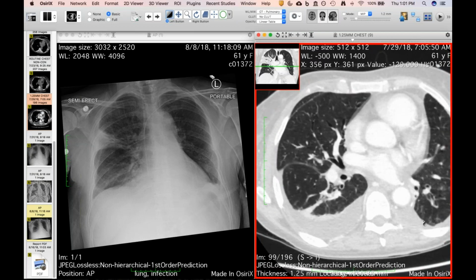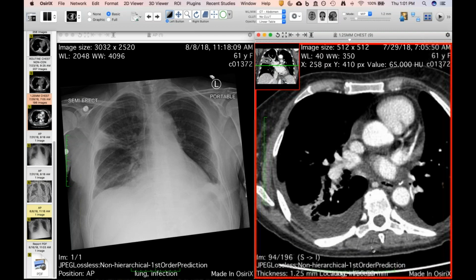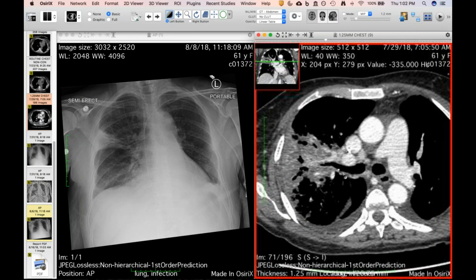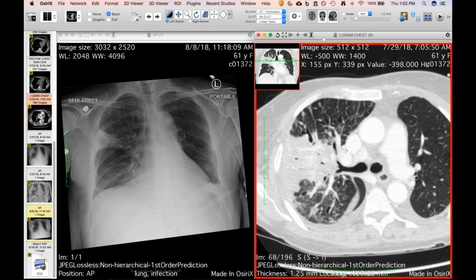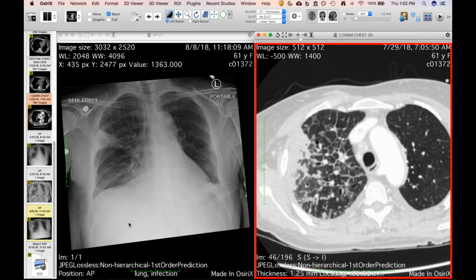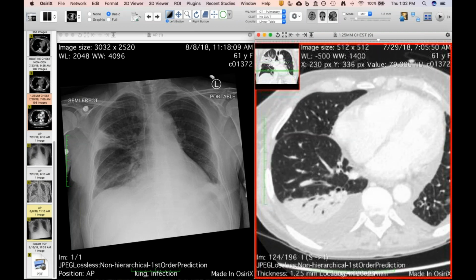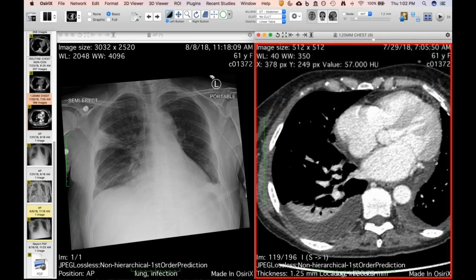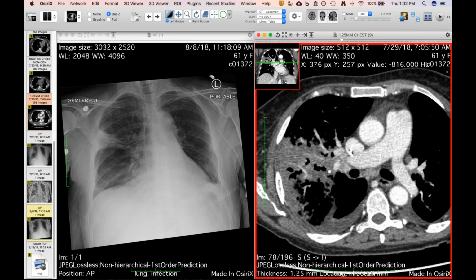Yeah, and she has a small left effusion too, and I think she was being hydrated on chemo and such. But I don't know if it's just an asymmetric edema in addition to her having the pneumonia, but just really quite a dramatic case. And she didn't have mitral regurg or anything like that. I mean, she's 61. No, I don't know. Her heart is okay. There was no acute MI with papillary muscle rupture or any other cause of mitral regurg.